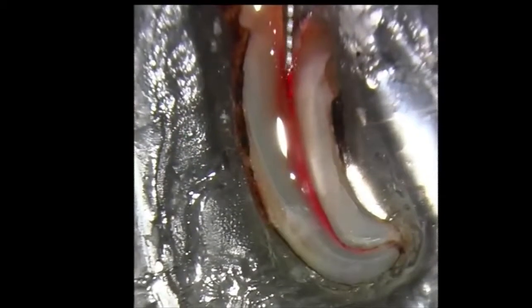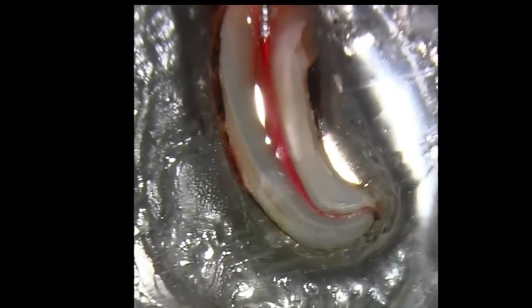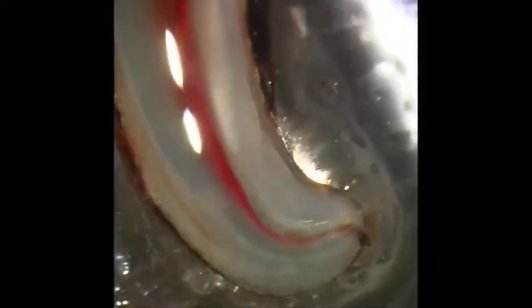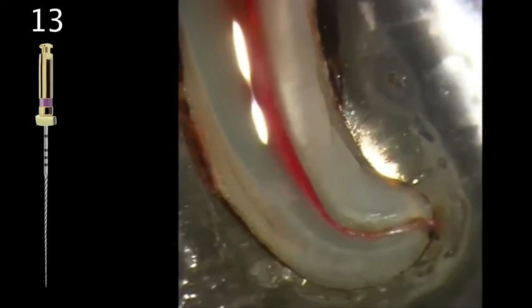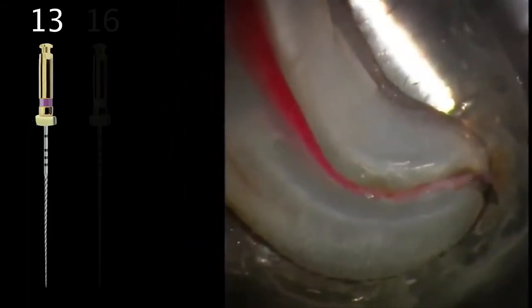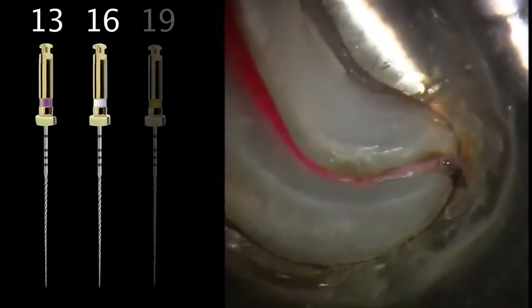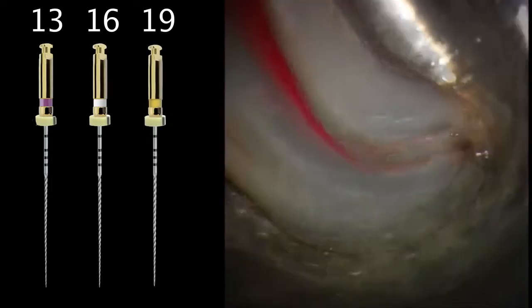Once established, a predictable technique for both enhancing the canal patency while remaining centered in the canal would be the use of a rotary NITI path file. This instrument comes in three sizes: 13, which is purple; 16, which is white; and 19, which is yellow. They all have a 0.02 taper.